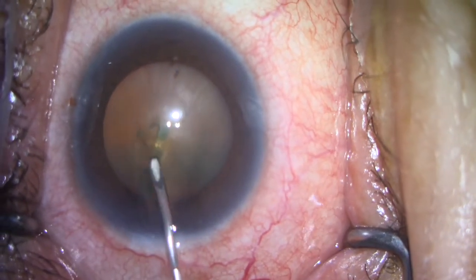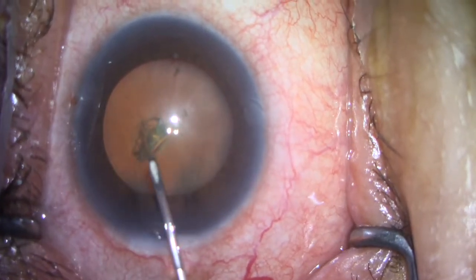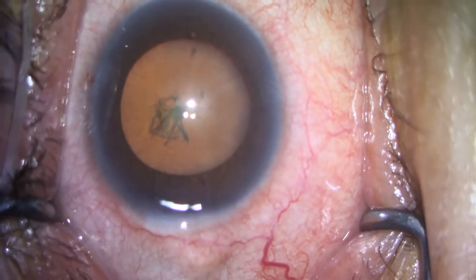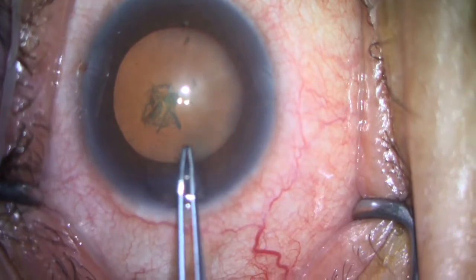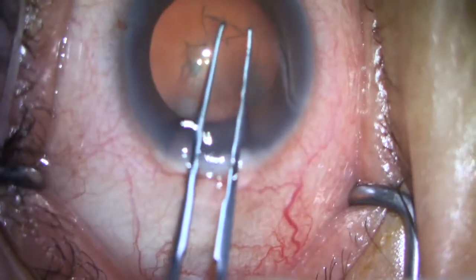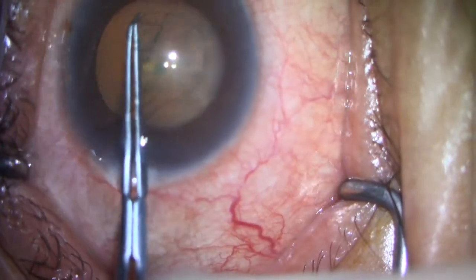As you can see here, I'm beginning the case, making a good capsulorhexis. Anytime we are considering placing a microincisional glaucoma device, the first step of the procedure is always to perform meticulous cataract surgery. If the cataract surgery has something that does not go appropriately, it then limits our ability to place the microincisional glaucoma device.